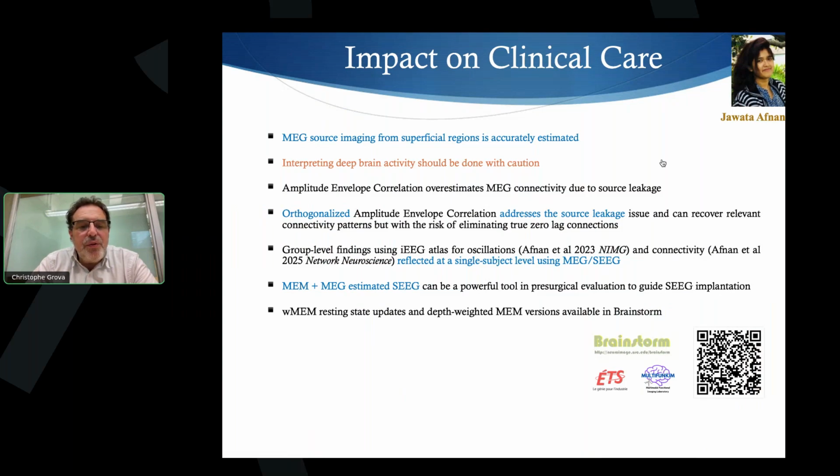One main issue, for instance: we showed that we could localize relatively deep regions when we look at the very initial rising phase of the spike. But often, even if we do that, at the same time we always get confounding or spurious localization more on the surface, and to disentangle those two is still not so clear.